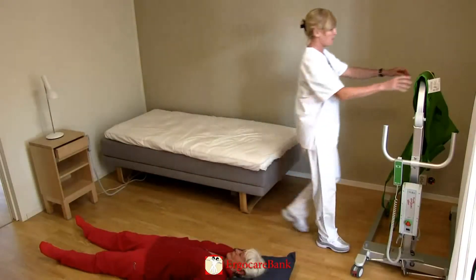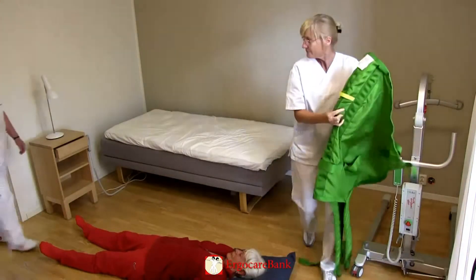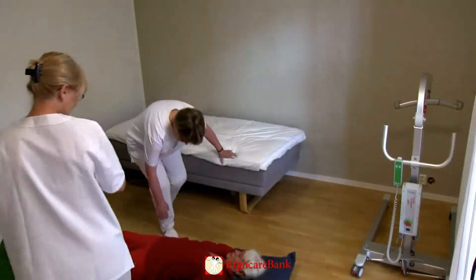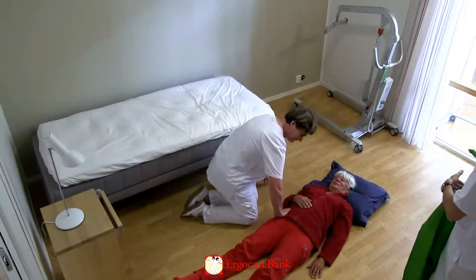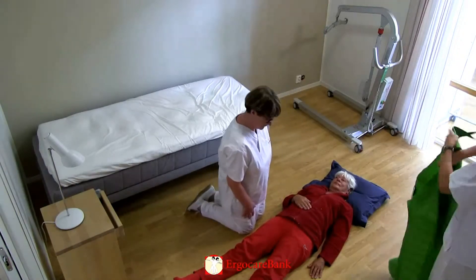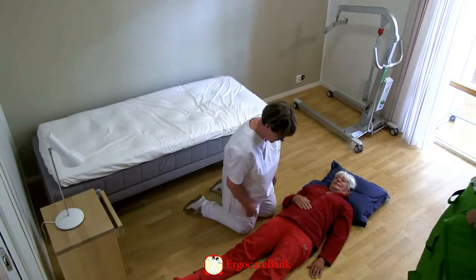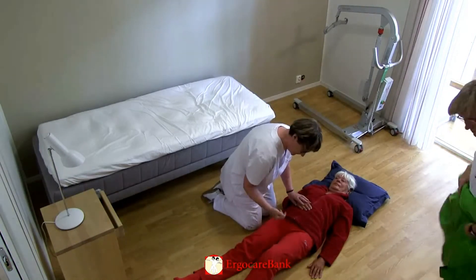They have decided to use a mobile floor lift to get Celia up from the floor and back into bed. Two staff assist in the transfer. They kneel one on each side of the patient, placing something soft on the floor to protect their knees. They explain to Celia how the transfer is going to be done.